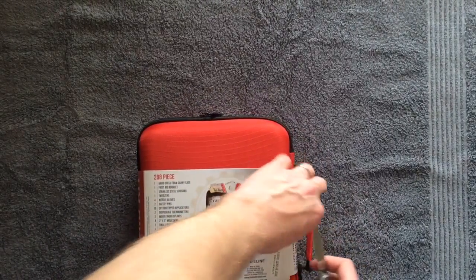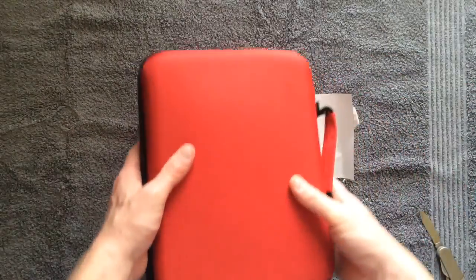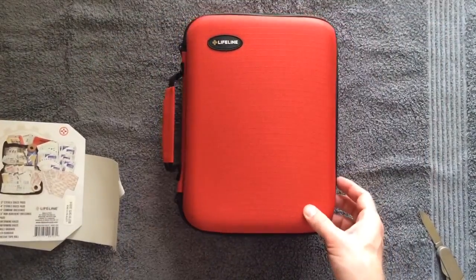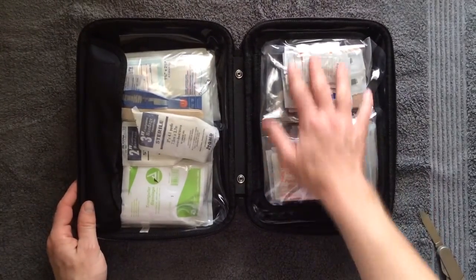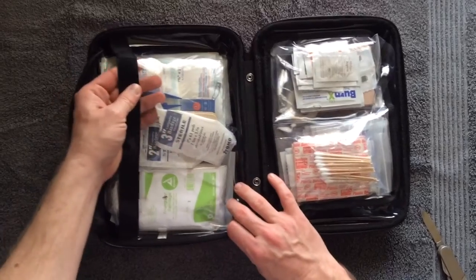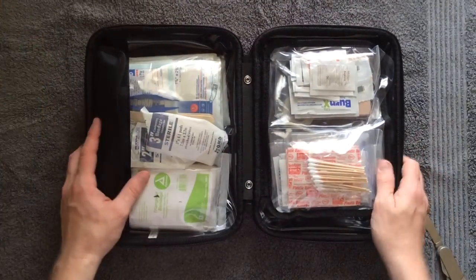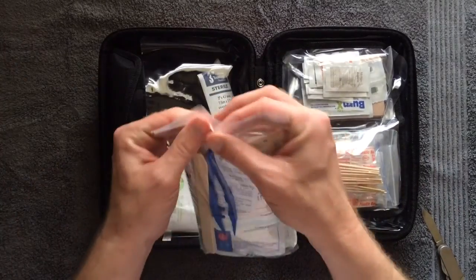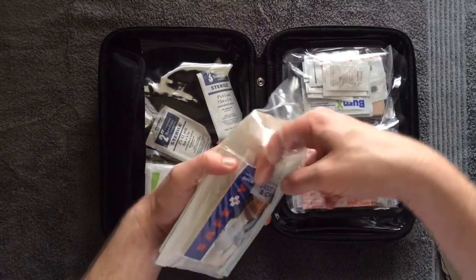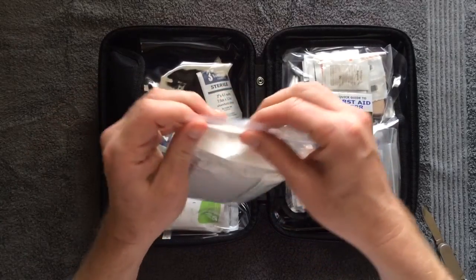I'm being careful to open this because I want to save the contents list. Everything is nicely packaged in pretty sturdy plastic with nice hook and loop fasteners. One thing I like about it — nothing falls out. I've seen some kits where stuff just goes everywhere when you open it. Everything here is in nice, seal-tight plastic bags so you can reseal them to keep contents from falling out. One thing in this bag is a first aid and CPR quick guide, which I'm going to move to a more accessible location in the bag.